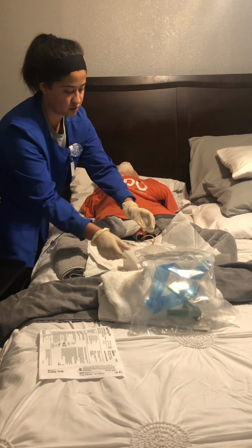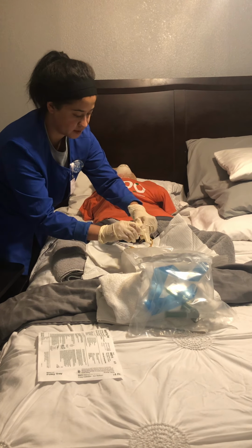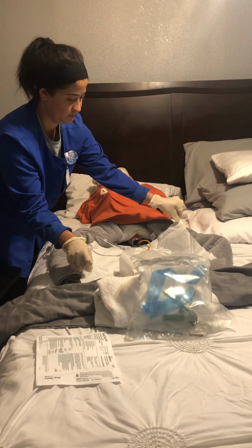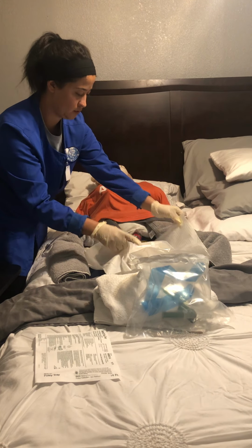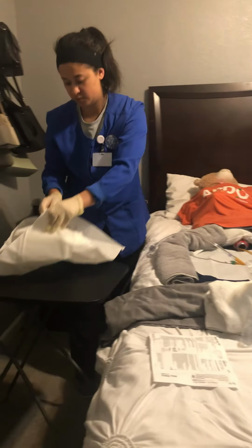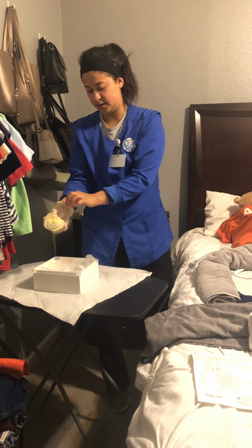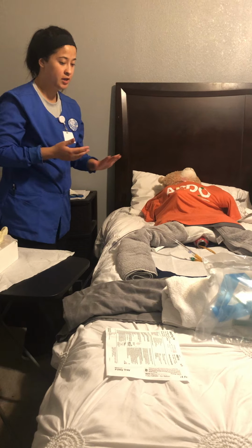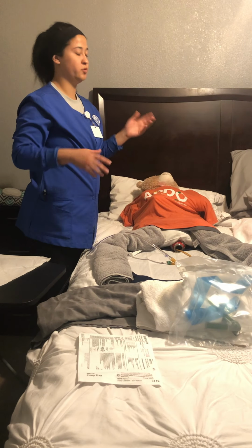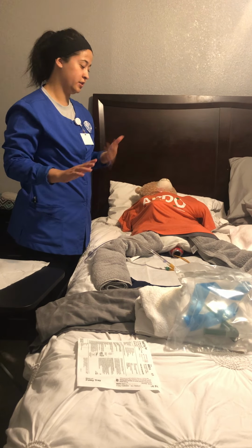And then I'm just going to disregard of all my supplies properly. So I would throw those in the trash, disregard of my gloves properly, perform hand hygiene. I would ensure my patient's comfortable, the bed is low, locked, and the call light is near.